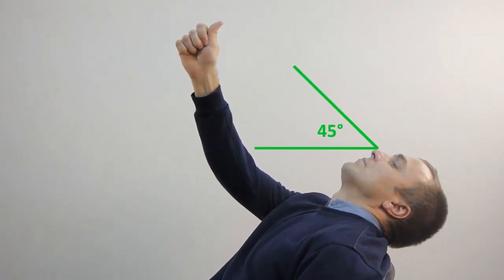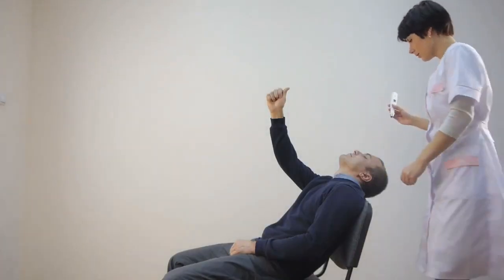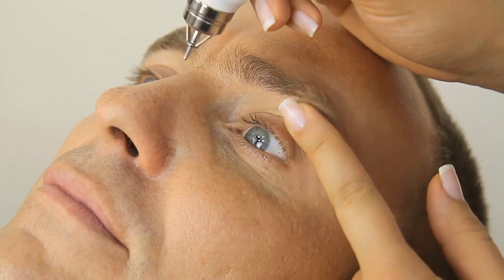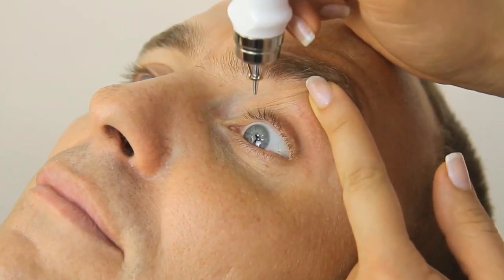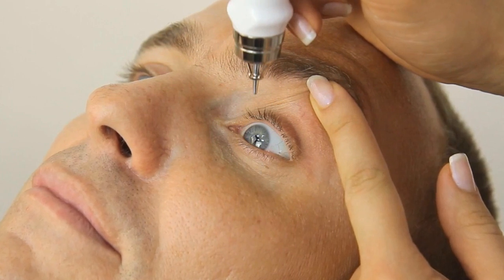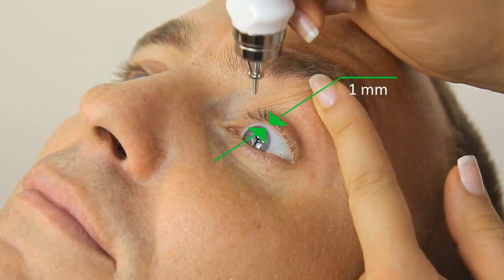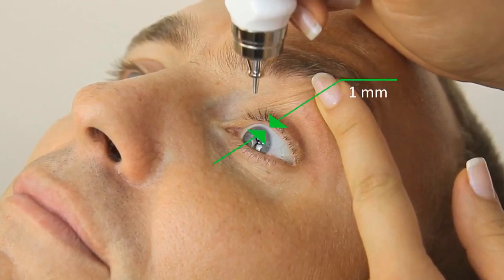You can use your thumb as a fixation point for the eye gaze. Stretch the upper eyelid of the patient's left eye with the index finger of your free hand, but do not press on the eyeball. The edge of the upper eyelid should be slightly above the limbus, showing a narrow strip of sclera between the edges of the limbus and eyelid. Hold the eyelid in this position during measurement.